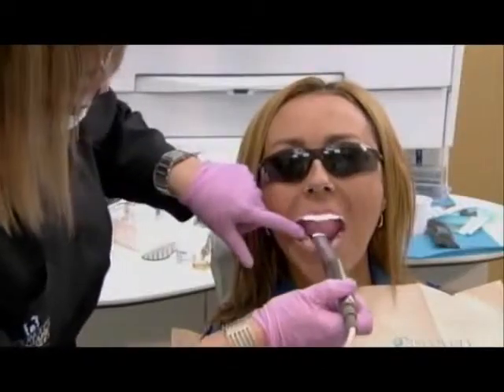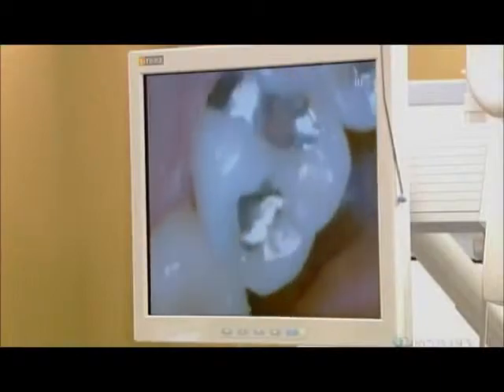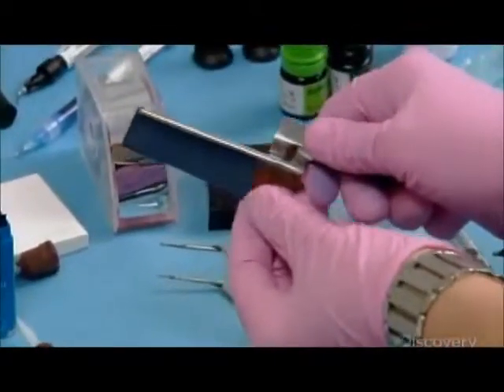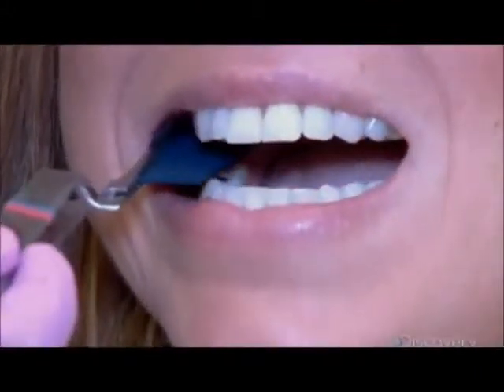After donning dark safety glasses, the patient is ready for her close-up. The dental assistant inserts a small video camera in her mouth to examine the problem area. She then inserts a strip of carbon paper between the patient's teeth and instructs her to clench her teeth, leaving markings that indicate her bite profile.